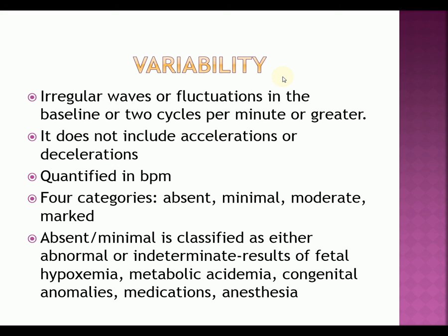Marked variability, we really don't know what causes marked variability, and because we don't know what causes marked variability, we just don't like it because we don't know what it means. We are dumbfounded by it.